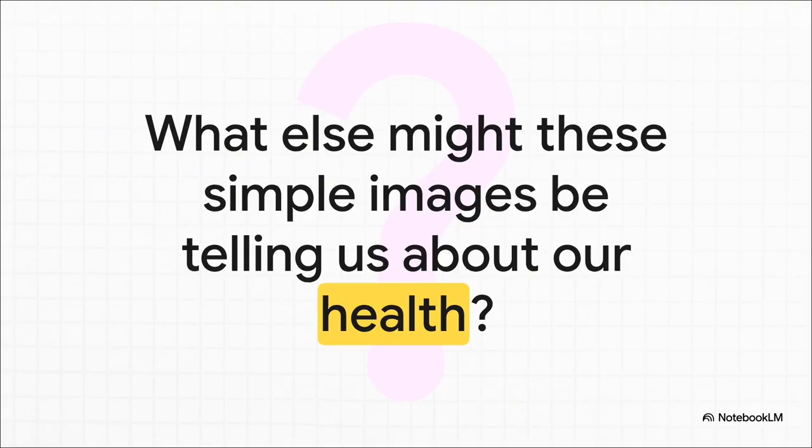It's a pretty incredible process when you think about it. And it just goes to show you that behind that simple little flash in the dentist's office, there's a whole world of science and skill and incredible precision. And it kind of makes you wonder, right? If a simple black and white picture of our teeth can tell such a detailed story, what other hidden stories are our bodies just waiting to tell?